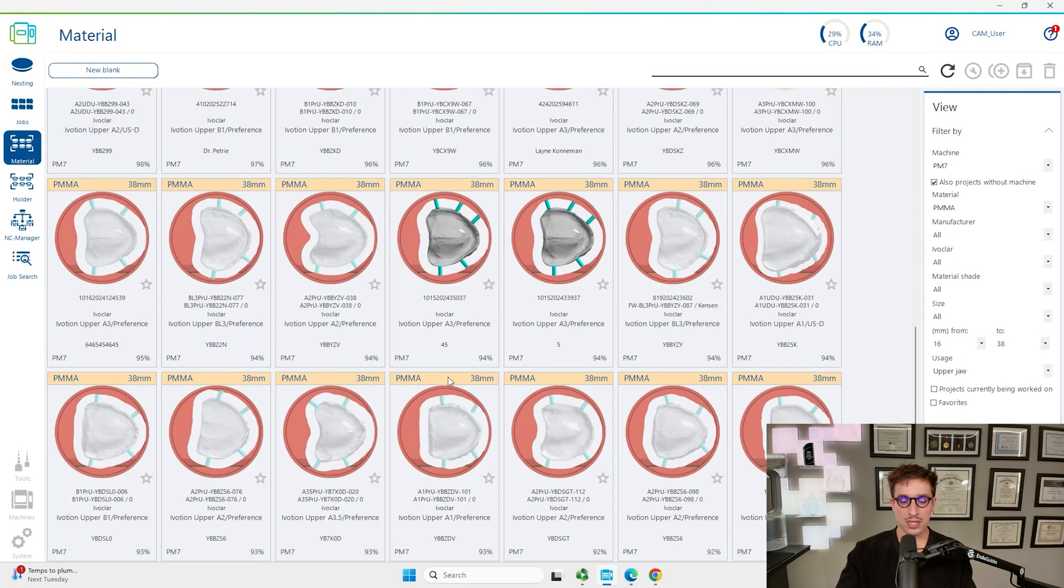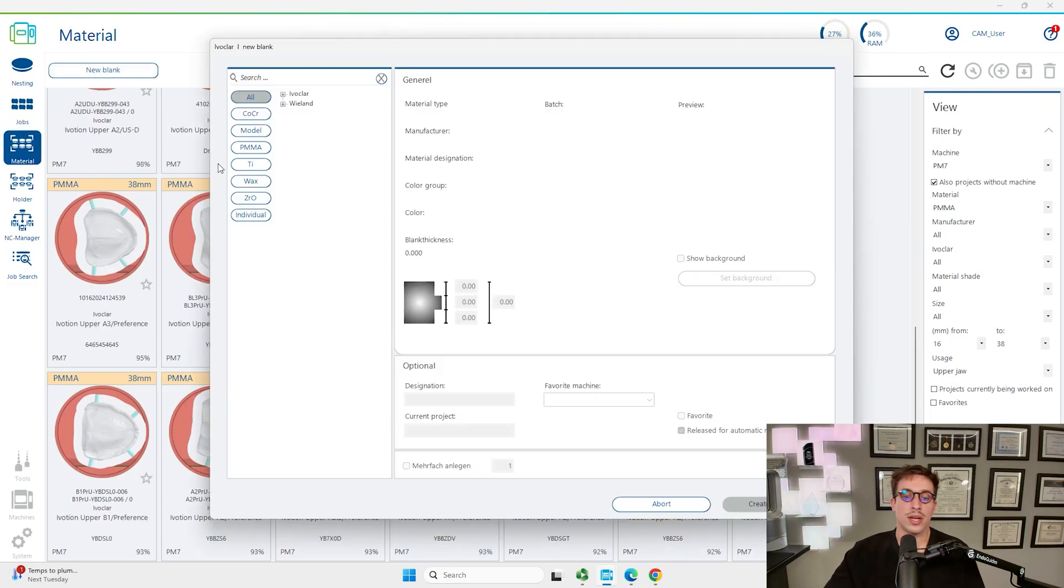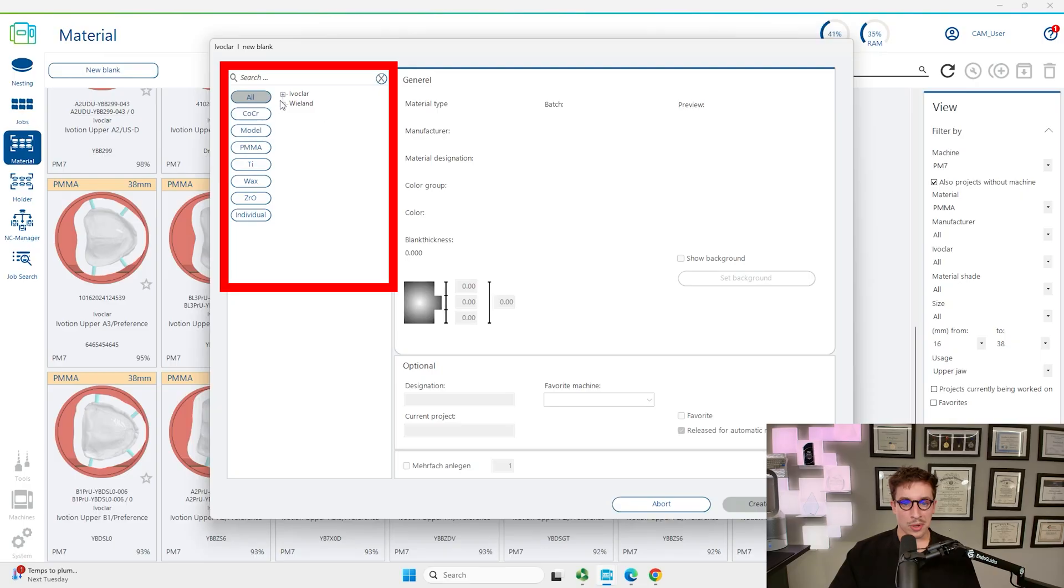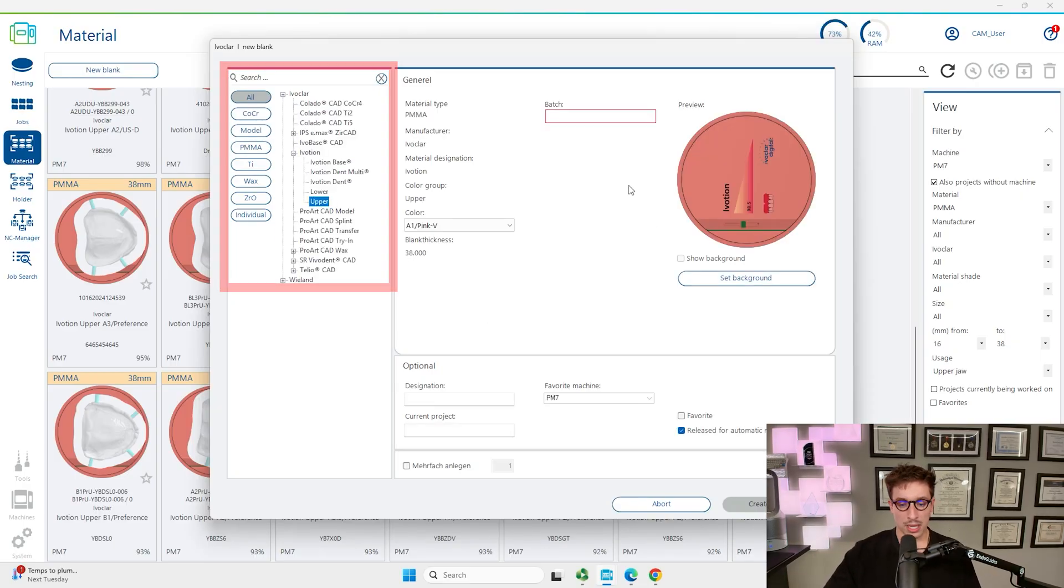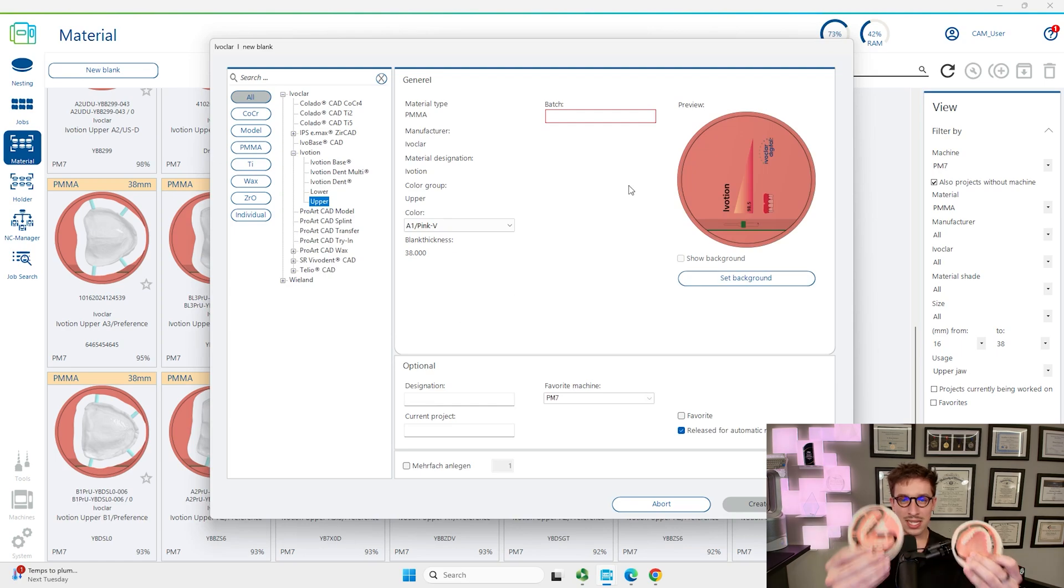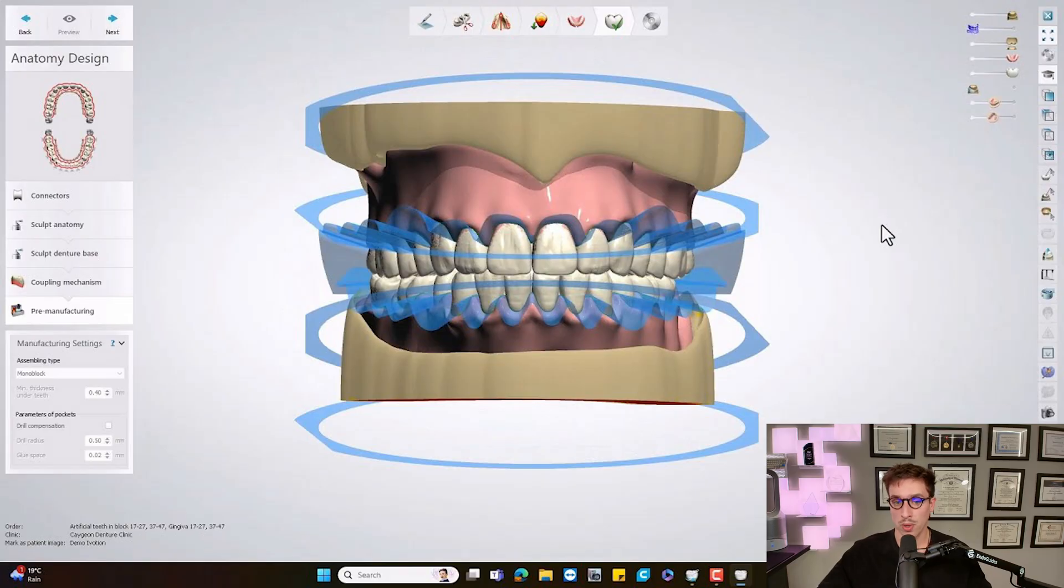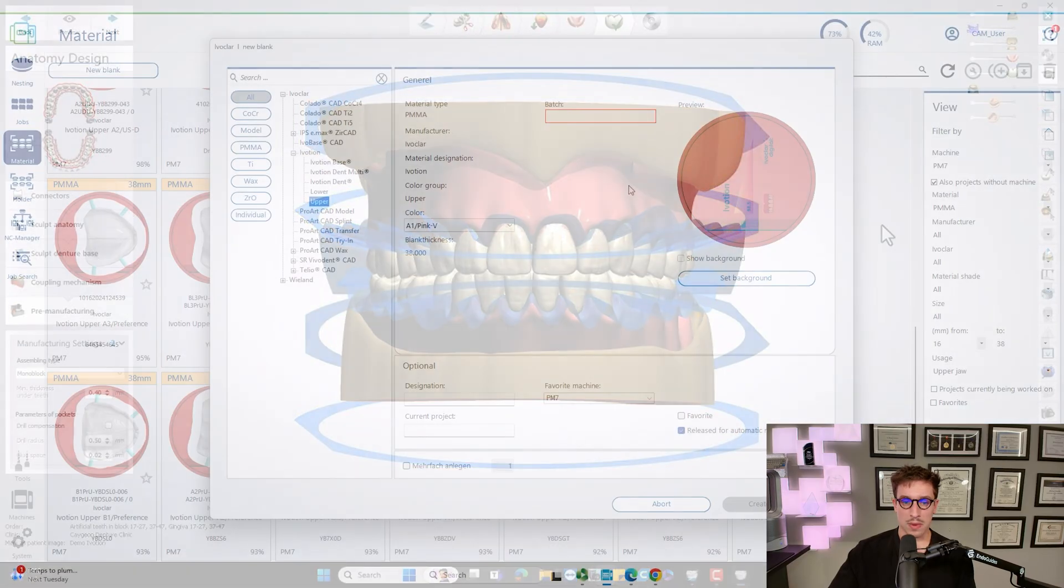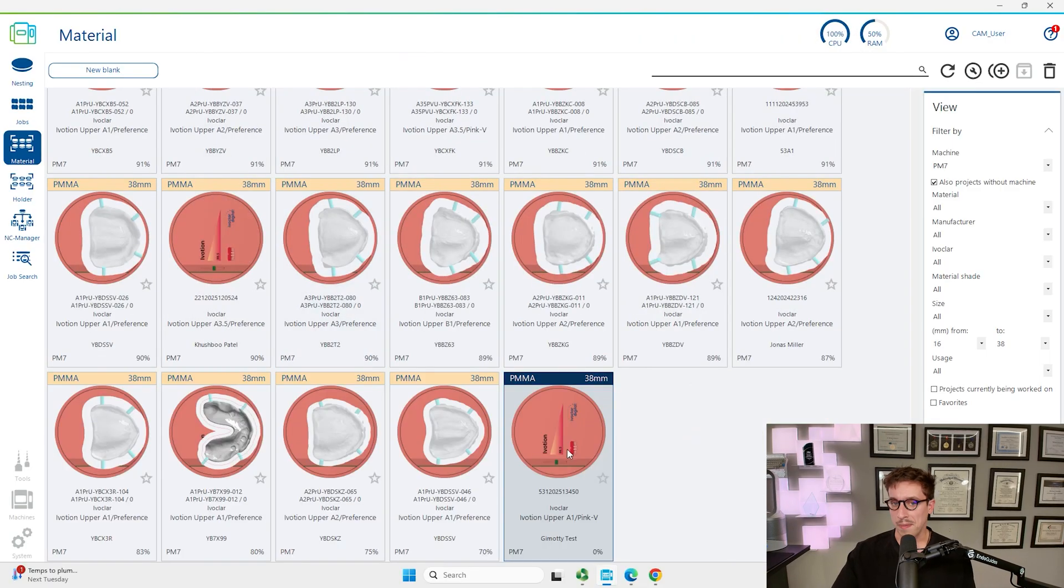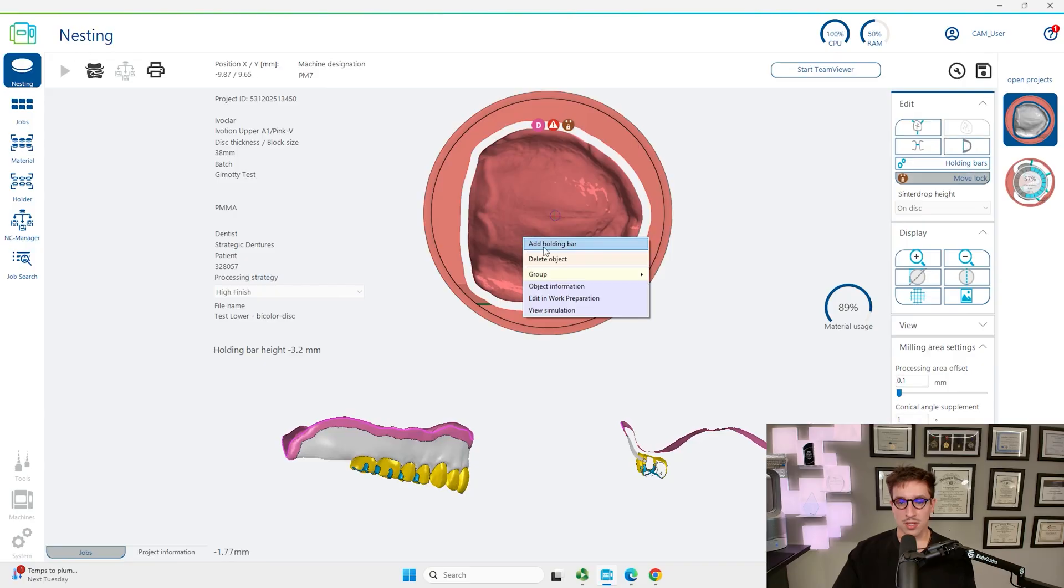We're going to do the same thing for the upper one. We're doing all and then I'm going to Ivoclar, Ivotion and then Ivotion upper, because obviously the delineation between the teeth and the gingiva color on these is going to be different for the upper and the lower. And it corresponds to what you see in your 3Shape software or Exocad software as well. We're going to click on upper batch, put something in here. The shade doesn't matter either. Double click on it, you can see it automatically nests here.